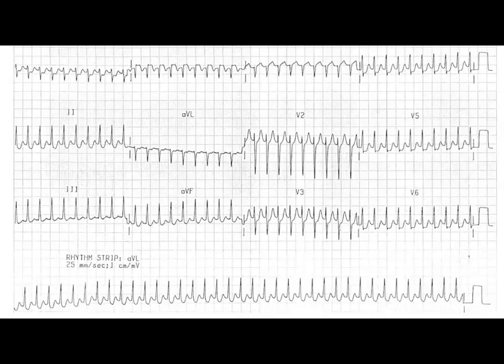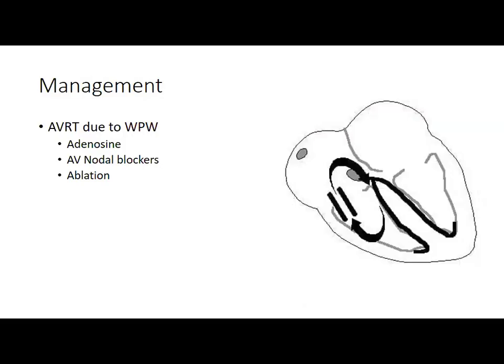But we can tell by the narrow complex tachycardia at a very fast rate that doesn't seem to be flutter-like, and certainly is not sinus tach, that this is most likely an SVT, the kind of which matters in the long run, but in the short term doesn't matter so much. You have to interrupt the AV node again. So it's vagal maneuvers, it's adenosine. Long term, once they find out where it's coming from, instead of ablating your slow pathway within the node that's causing your problems, they just go in and wipe out the accessory pathway.